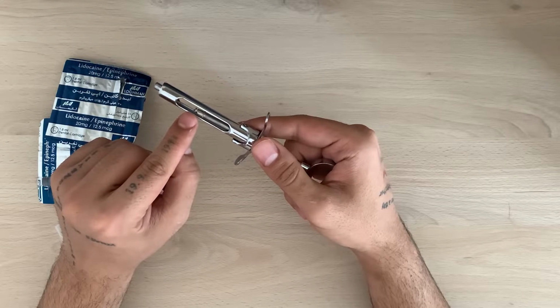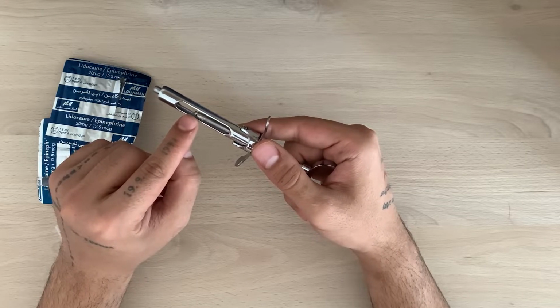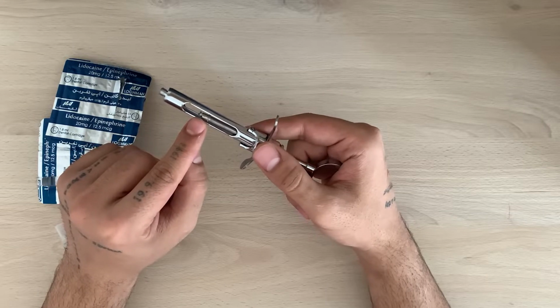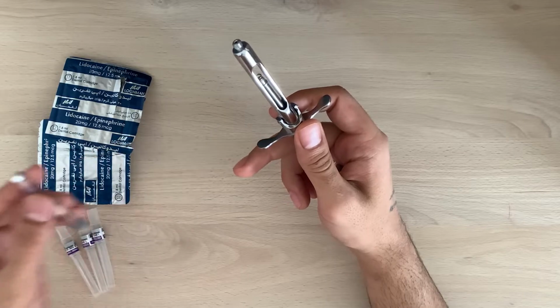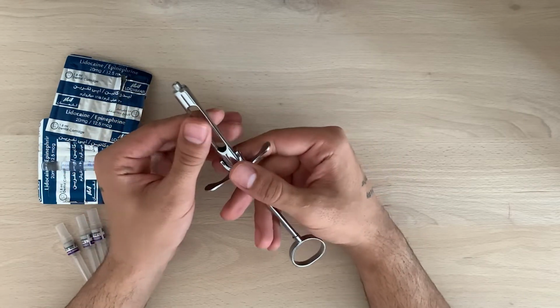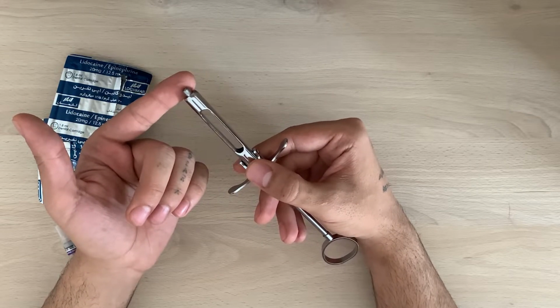At the top of the piston rod, there is a part which is called the harpoon. It's a sharp part which penetrates the rubber stopper once the carpule is pushed. This part is the rubber stopper. And the last part is the needle adapter, where the needle will be placed.